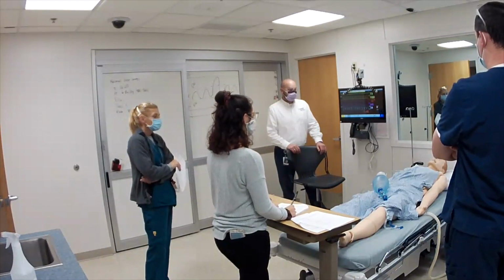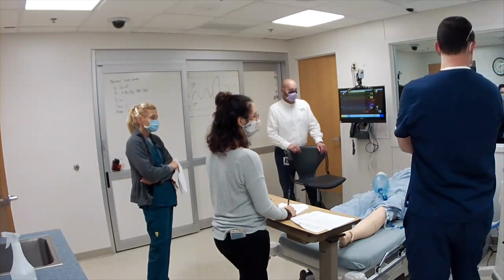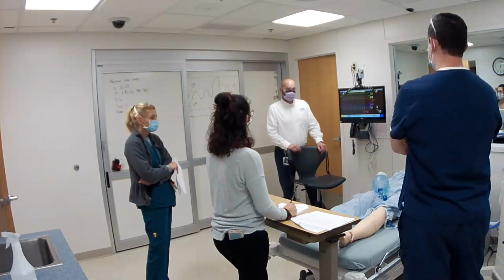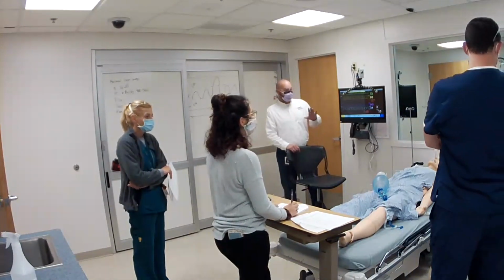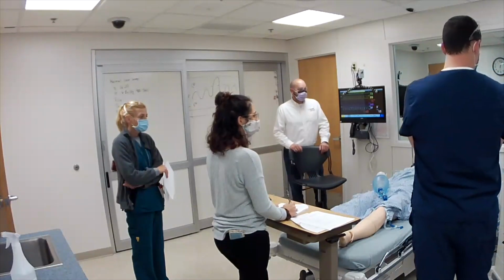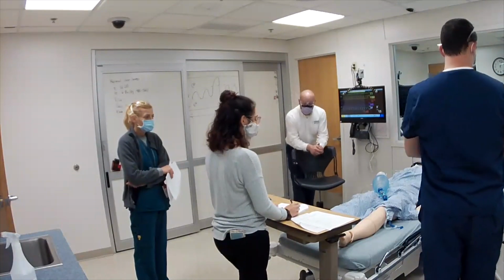Where are we? We talked about our vent settings. So the next thing is we should also get a baseline ABG. Let's do that. Yeah. So through the magic of technology and science, Shannon, will you go back to the main page on the vent for me? Yeah.